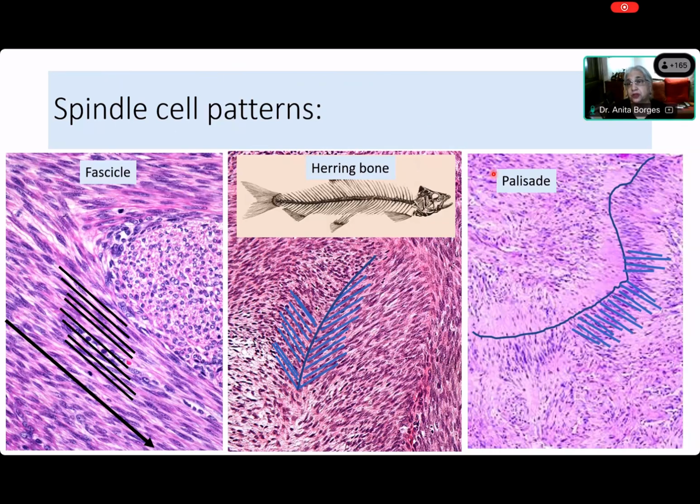So what is the minimum thing that you require? I can't be running to the book every time to check whether it looks like a fence made up of elongated slats, cells parallel to one another. There are many kinds of fences, but a palisaded fence has got cells that are elongated, with or without elongated nuclei. It doesn't matter what the nucleus is for a palisade. But if I'm talking about spindle cells that are forming a palisade, then yes, the nuclei have to be elongated, because that is what defines a spindle cell. Do you understand that now, Kedar? Does everybody understand it? If there is a problem anywhere, then please let me know. It's important.